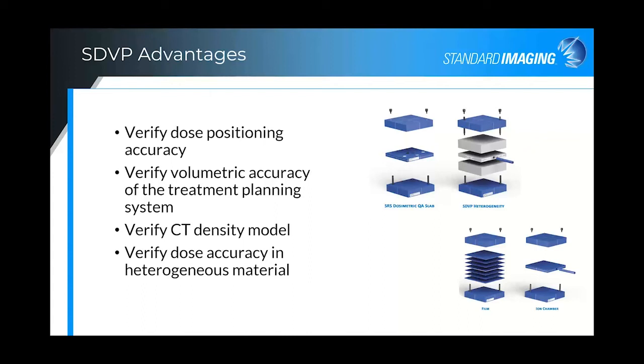In various inserts, you will notice components similar to those I already went over for Lucy. The advantages include verifying dose positioning accuracy, volumetric accuracy, inserts for verification of CT density, and verifying dose accuracy in a heterogeneous material. And I'm sure I'm missing a few.